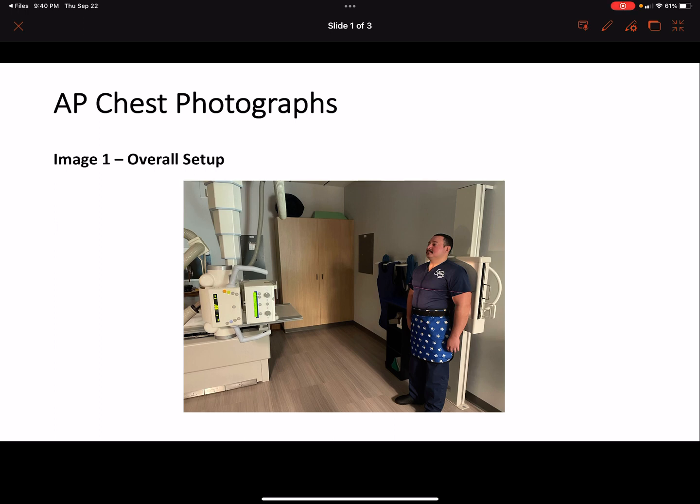I met the patient and asked him to tell me his name and date of birth so I could verify his information was correct on his wristband and chart. After the verification process, I escorted him to the wall bucky and donned the lead apron for shielding.